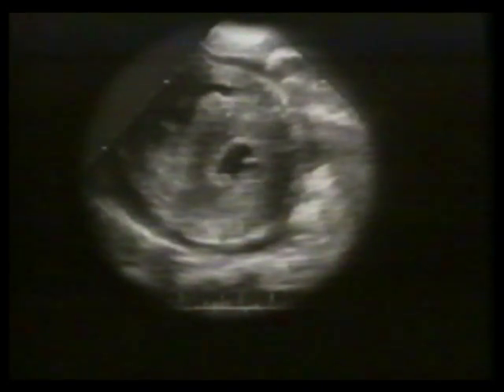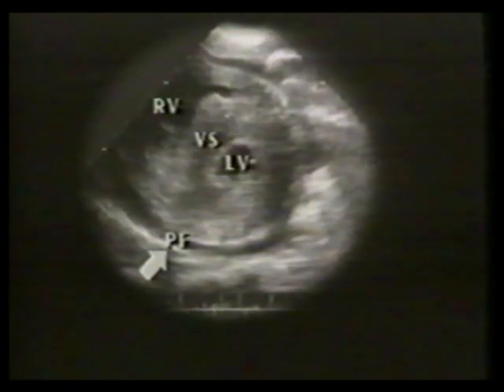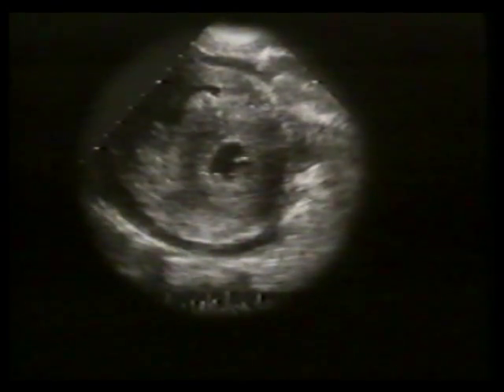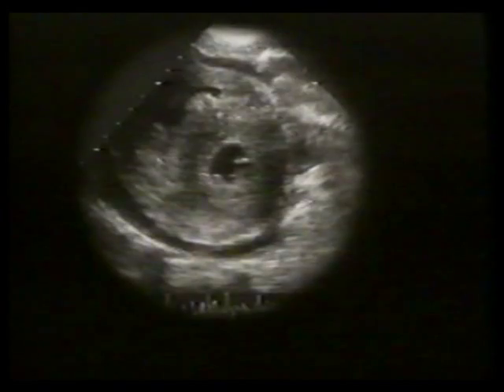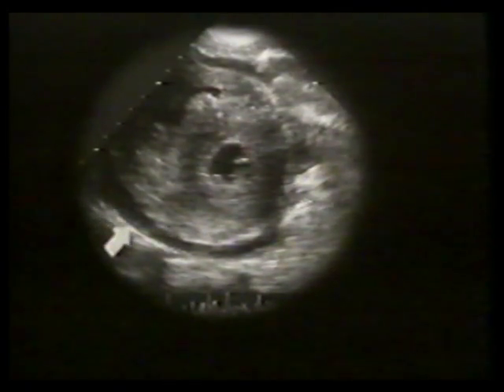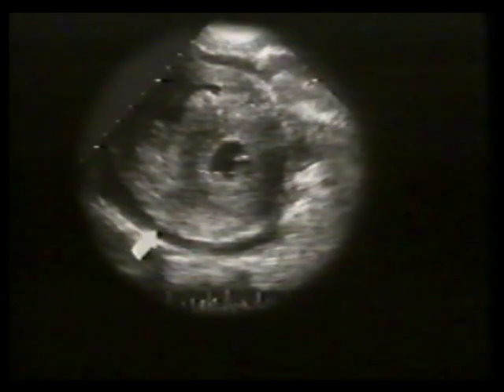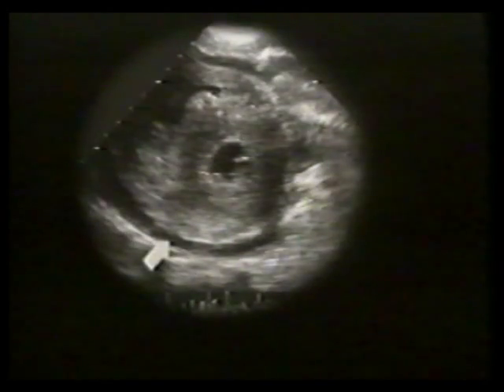In this still frame and all subsequent examples, pericardial fluid will be indicated by the abbreviation PF. This patient has cardiac amyloid with a small pericardial effusion, particularly evident in this systolic frame. This bright white line is the parietal pericardium, and this small echo-free space is the pericardial fluid. There is also fluid anteriorly, adjacent to the right ventricle.